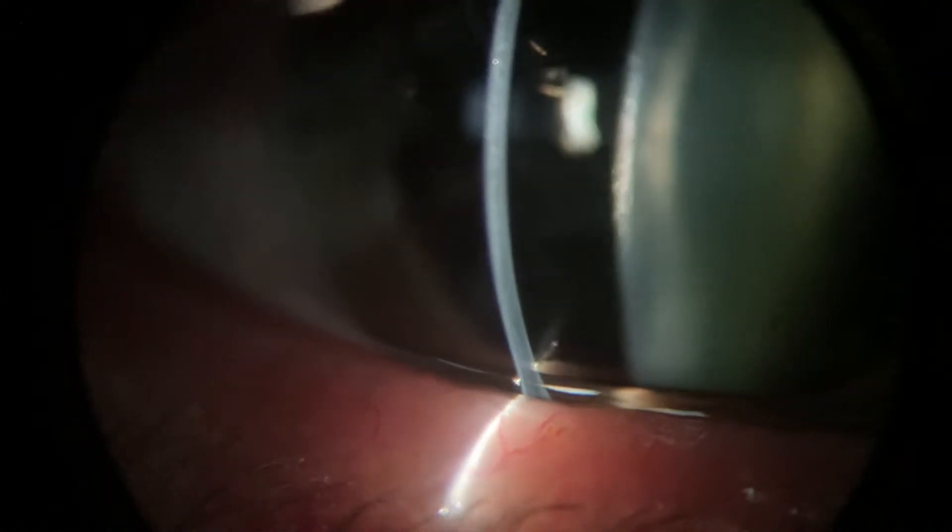Everything looks really clear there, which is nice. Let's just do that again for me, looking up to the ceiling, down to the floor, and straight ahead. So nothing at all there of any concern in the vitreous. It's got a deep anterior chamber and everything looks fine.